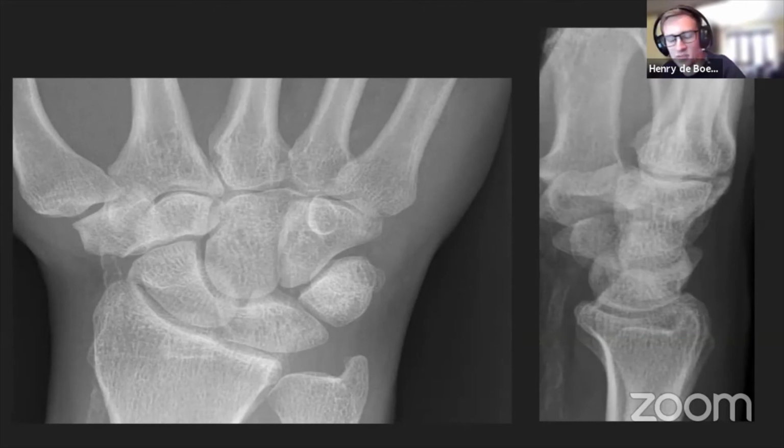And I've just realised, I don't know if you all know, but when we're describing angulation or displacement, we talk about where the distal bit has gone relative to the proximal bit. So if we get some examples, I'll talk that through, but you have been describing them correctly in the answers that I've seen.